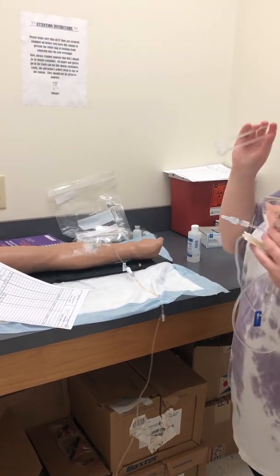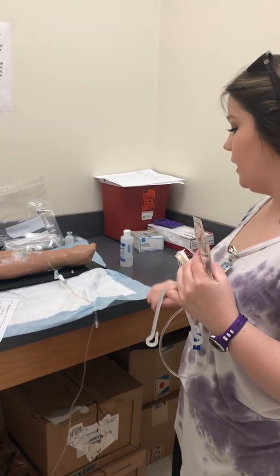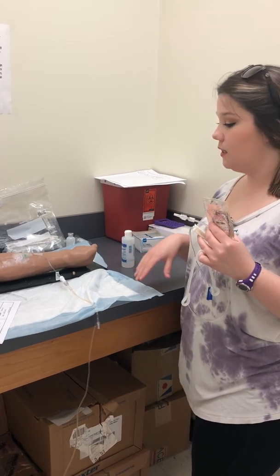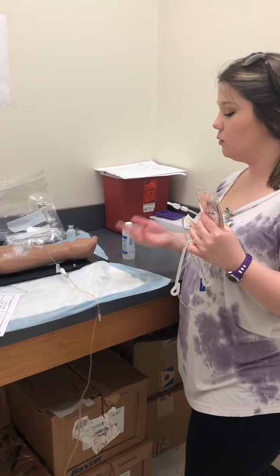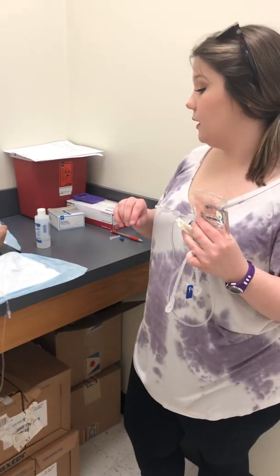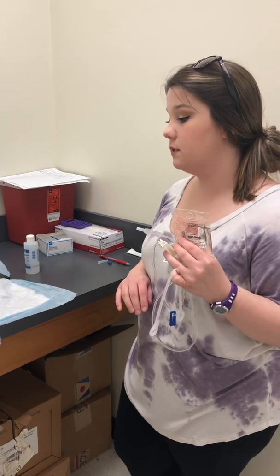And I've also got my hanger. Okay. And now that I have assessed the patient, I'm going to say, I need you to report any dizziness. I need you to report any diarrhea, and any bloody stools and things like that, and report any muscle spasms.